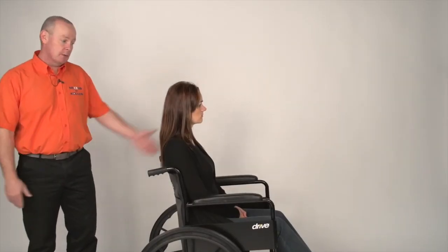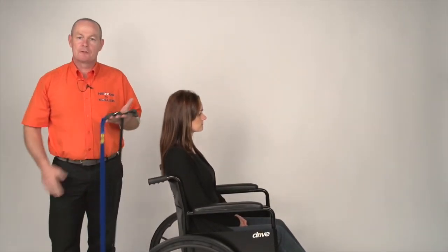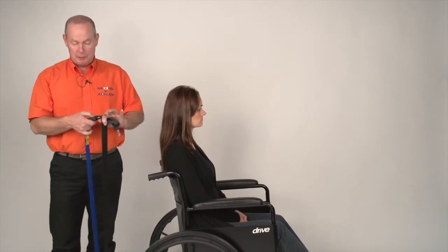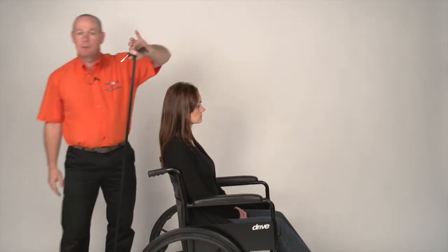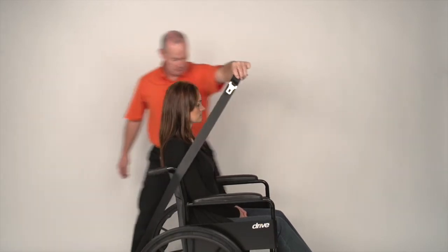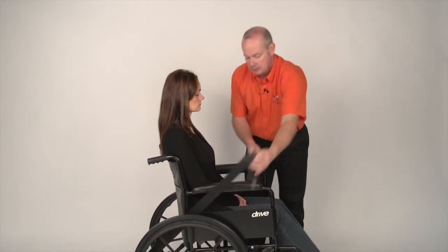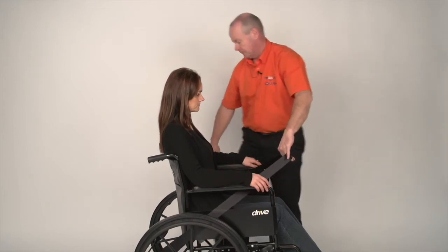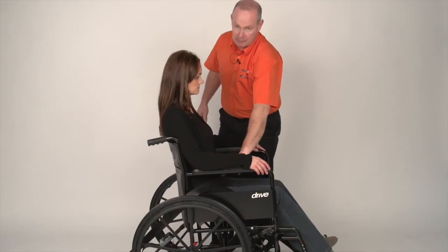We're now going to put the passenger harness on, so we have a passenger in our wheelchair. Take hold of the passenger harness — it is colour coded for ease of use: black for the lap, blue for the shoulder. They're all split rails. To put it on, split the rail and concentrate on the black lap part first. Come round the outside of the person — the lap belt will either come underneath the armrest or down through the gap in the wheelchair. Place it underneath, come under the other side, put the tongue into the buckle, and gently lower the lap belt into the lap.